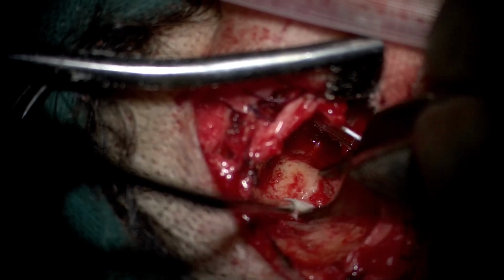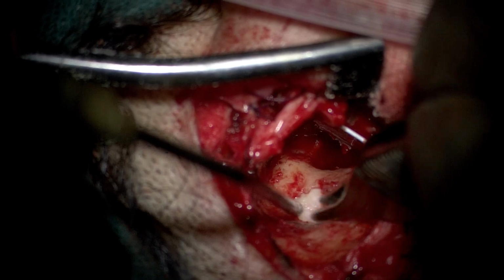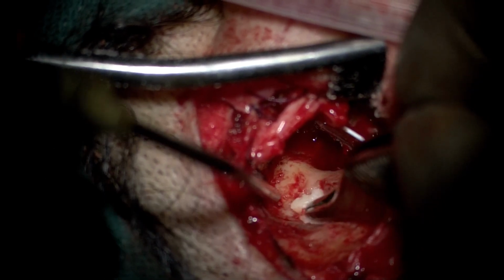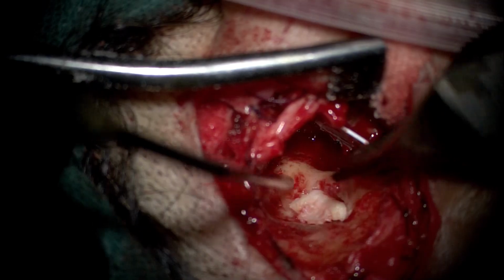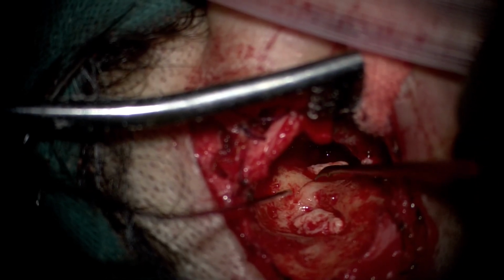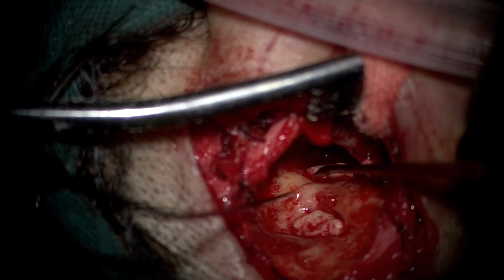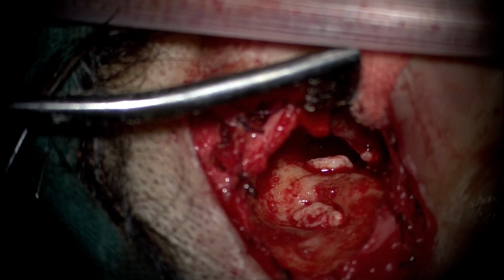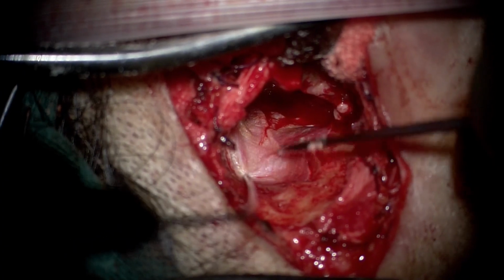You can see how now we are using conchal cartilage to obliterate the posterior and the inferior part of the cavity. So we use conchal cartilage full thickness. We can use 1, 2, or 3 portions depending on whatever we retrieve from the concha. If it is less, we can also use some from the tragus, but here we are just using conchal cartilage.